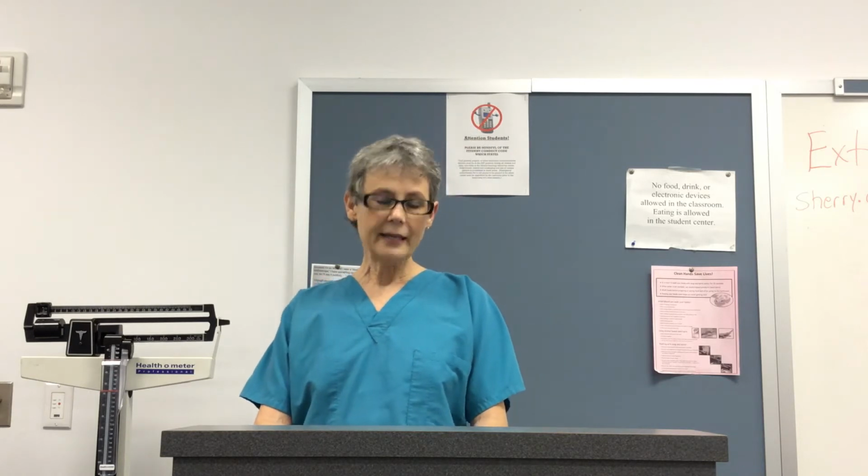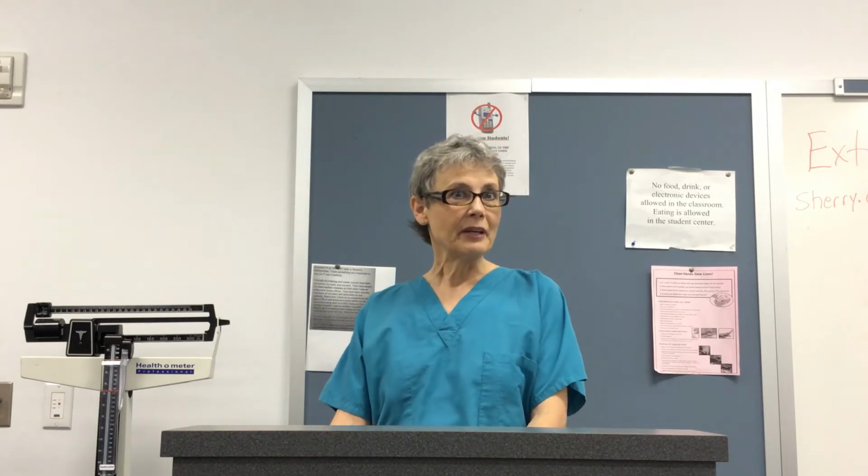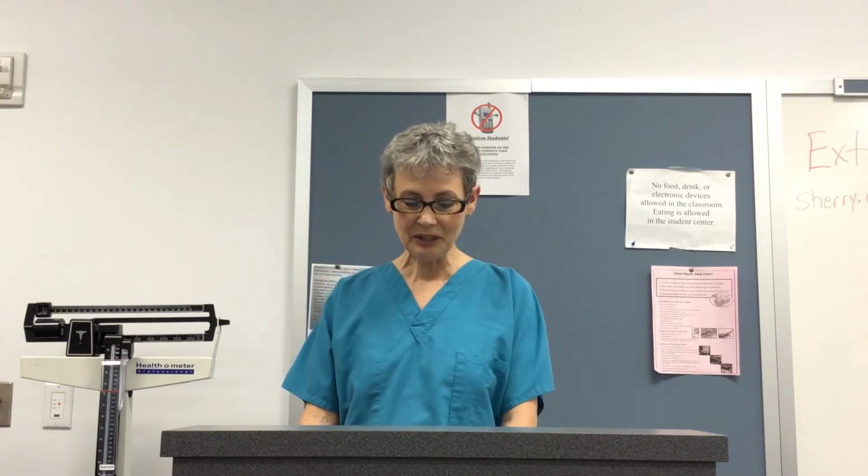When we initiate IV therapy, we have some expected outcomes. Of course, we want our patient to be free from a vagal reaction when we are starting the IV. If the patient starts to sweat and have clammy skin, becomes dizzy or lightheaded, their ears may start ringing, having pale skin, nausea or blurred vision, these are all signs and symptoms of a vagal reaction. So you may have to stop the procedure, allow the patient to recover, and get a set of vital signs.